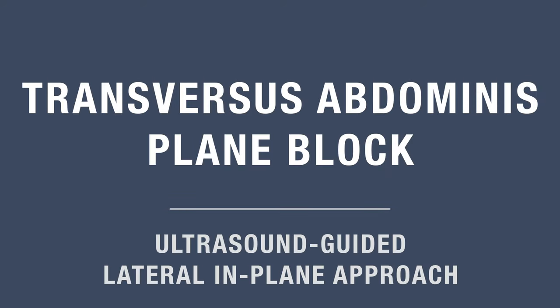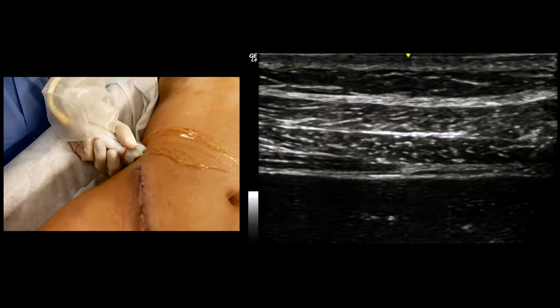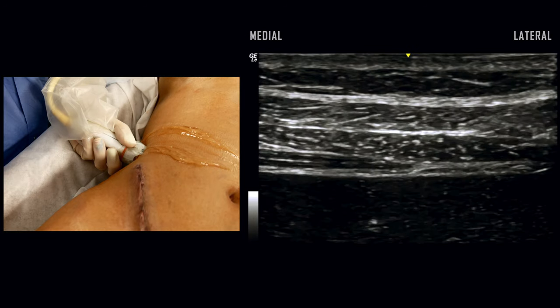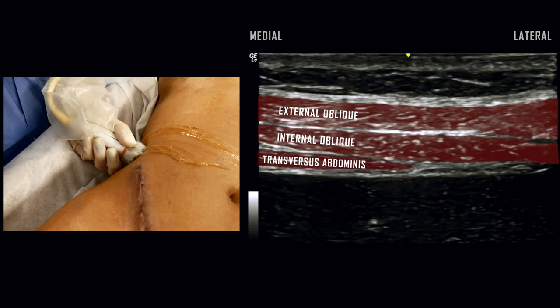The patient is positioned supine with the transducer at the midaxillary line between the subcostal margin and iliac crest. Three distinct layers of abdominal wall muscles are seen, including the external oblique, internal oblique, and transversus abdominis.